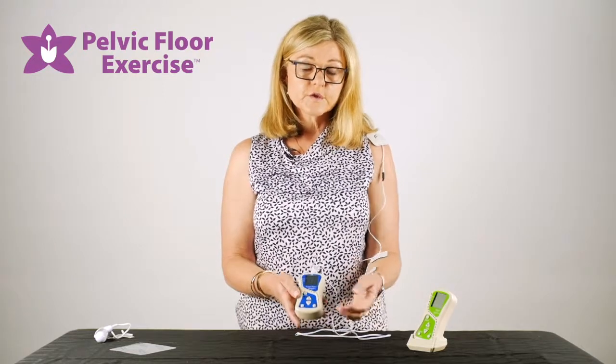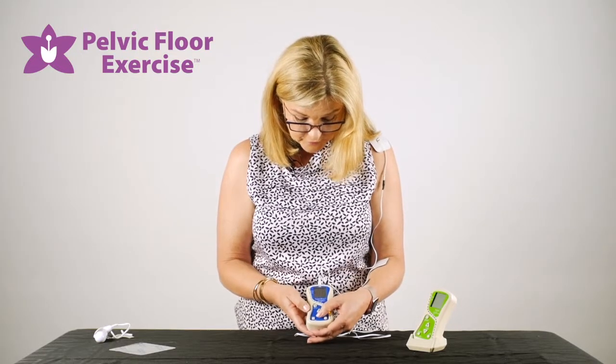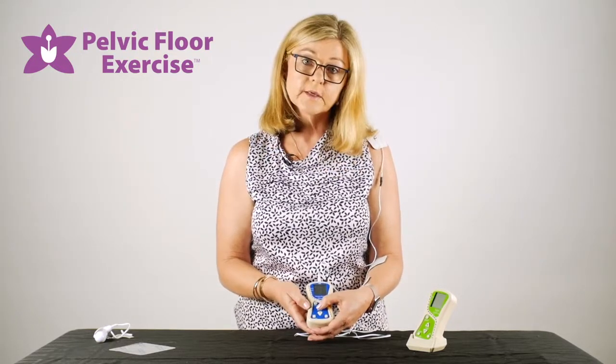If you find that the threshold is too high or too low, you can use the plus and minus buttons here to reduce it or increase it.